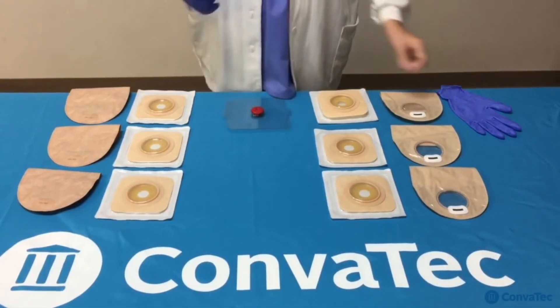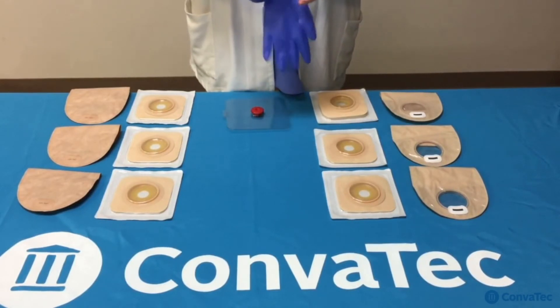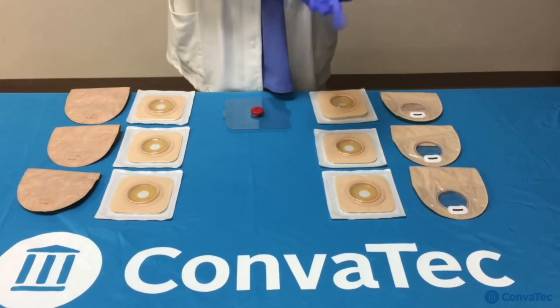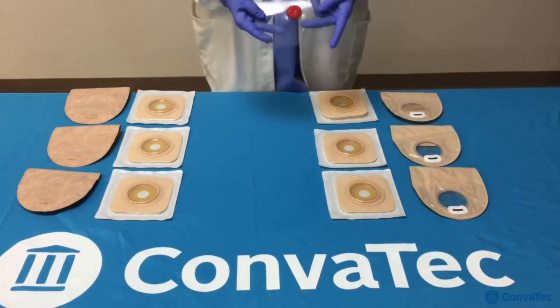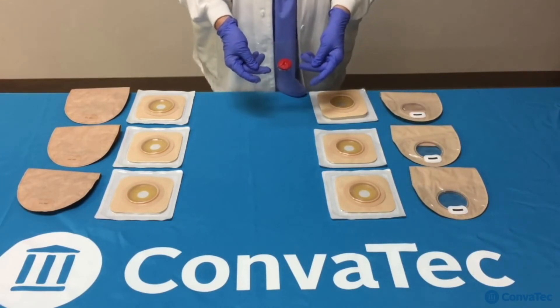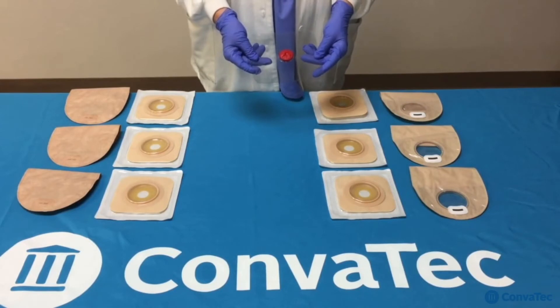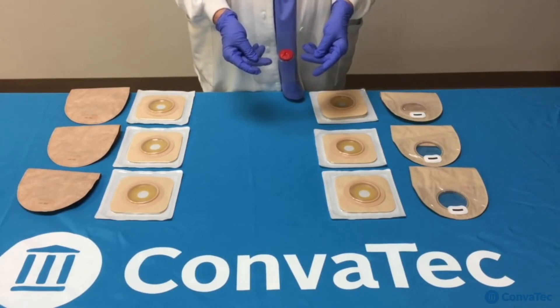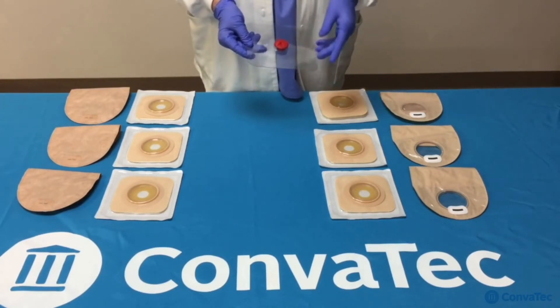I am going to use a two-piece moldable durohesive with the accordion flange and a hydrocolloid collar. Here I have a stoma that's oval-shaped and measuring one and an eighth to one and a quarter, so I will be using a 57 millimeter skin barrier. You would prepare the skin via your usual routine.